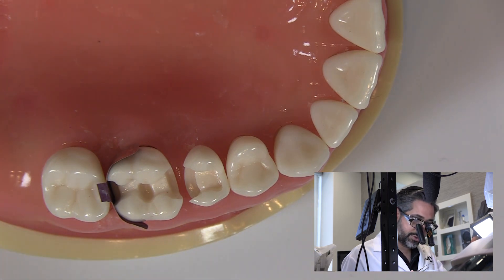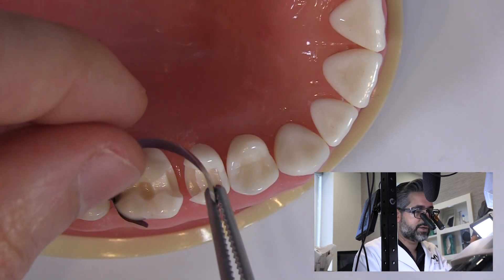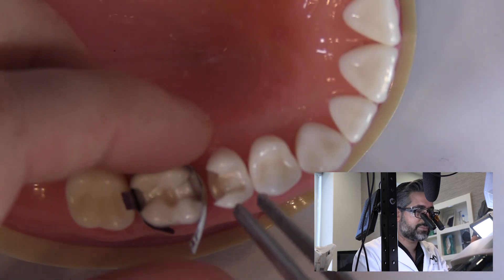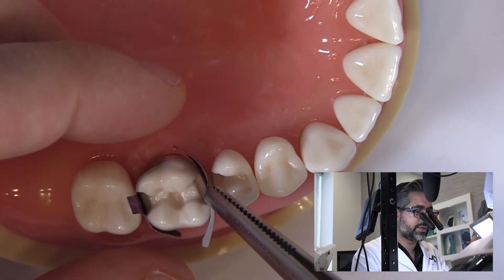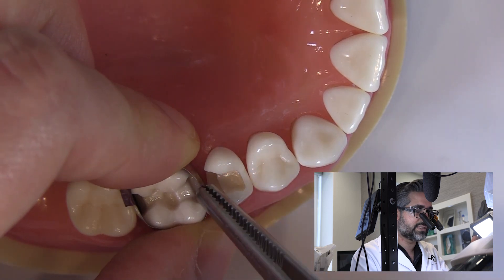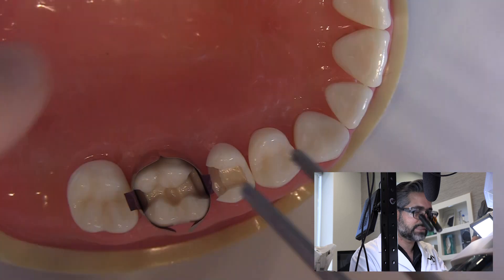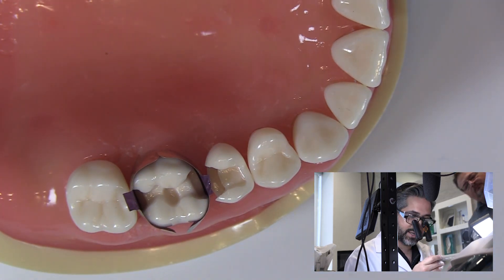Then when we do the other side, sometimes I cut it a little bit shorter so that they don't overlap. You're going to see here as we come in that they're going to be overlapping a little bit sometimes. If that's the case, I'll cut one a little bit shorter so that they don't overlap on the buccal and lingual. But if it fits and we don't need to adjust, that's fine. I'll place this here and just use a wedge lightly to keep it in place, but I'll focus on restoring the distal contact first.